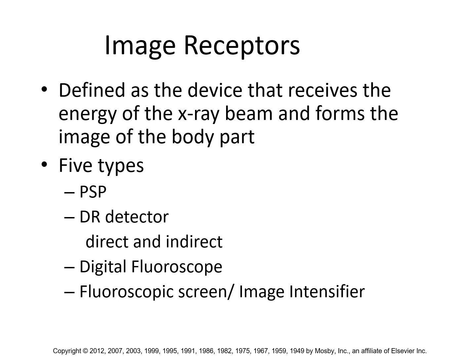Any digital image that you see, whether it's an image on your cell phone camera or an image by a digital X-ray technology, is actually a cluster of pixels, very, very small, jammed close together, and your eyeballs are fooled into thinking it's a continuous image.